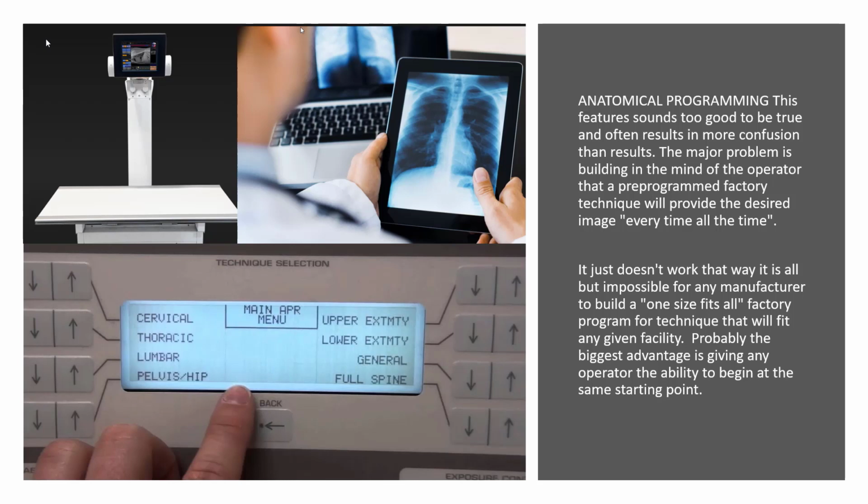So let's start with anatomical programming. This feature sounds too good to be true, and oftentimes the problem is that it builds in the mind of the operator that the pre-programmed factory technique will provide the desired image every time, all the time. It just doesn't work that way. It is all but impossible for any manufacturer to build a one-size-fits-all factory program for techniques that will fit any facility.